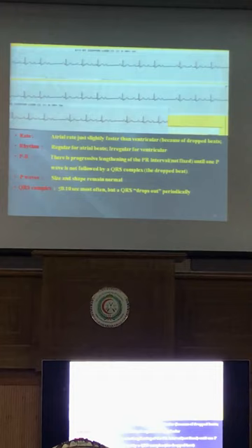Second degree heart block type one: this is second degree because some beats are passing — P then QRS, P then QRS — and some are blocked — P without QRS. Why type one? Because the PR interval progressively increases with each cycle until a beat is dropped. You can see the PR getting bigger and bigger until a QRS is dropped.